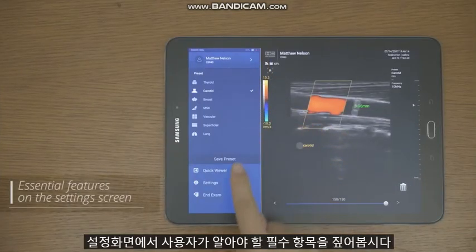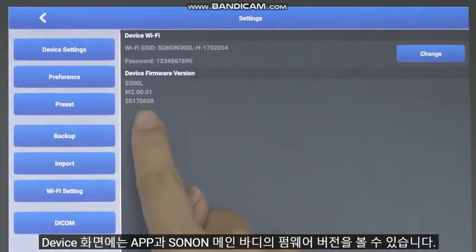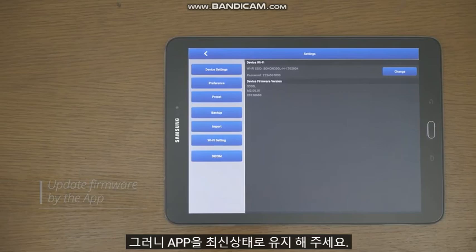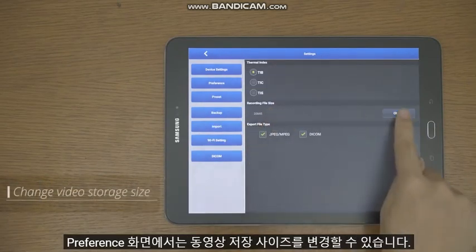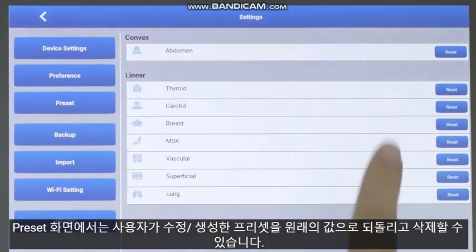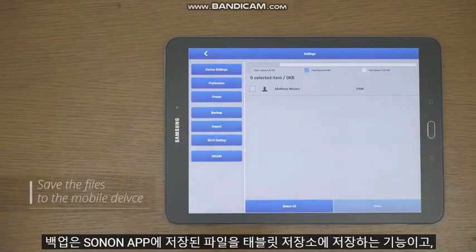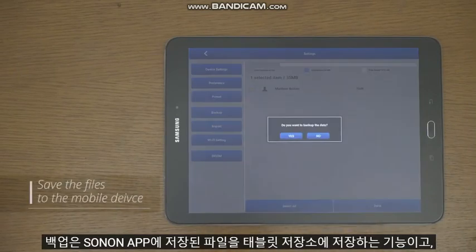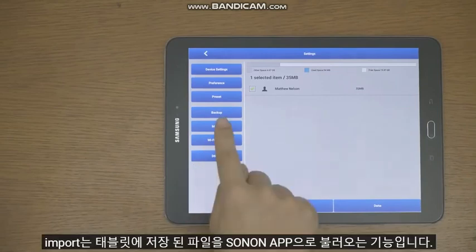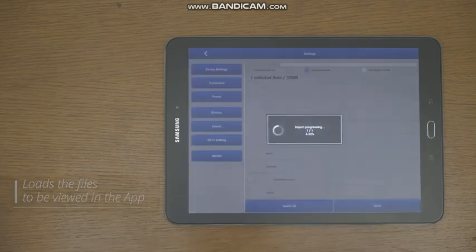Let's take a look at the essential features that users must know on the settings screen. The device screen shows the firmware versions of the app and Sonon device. Sonon can update the firmware through the app, so keep your app up to date. In the preference screen, you can change the video storage size. In the preset screen, you can return a preset you created or modified back to its original value, or even delete it. Backup is the function that saves files stored in the Sonon app to the mobile device storage, and import is a function that loads files stored on the tablet into the Sonon app to be viewed.